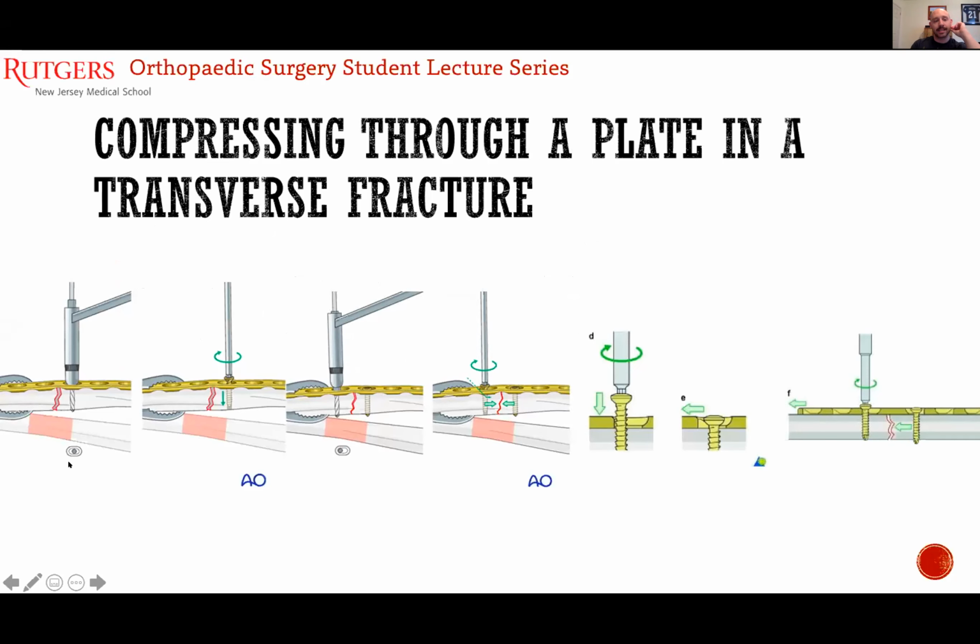It's going to be in the center of the hole. And if you remember, the way the screw holes are oriented, if you're looking at them from the side, there's an obliquity of the screws where there's an incline. So if you drill it concentrically, once you start threading in the screw, it's going to just go concentrically to the center of the hole.